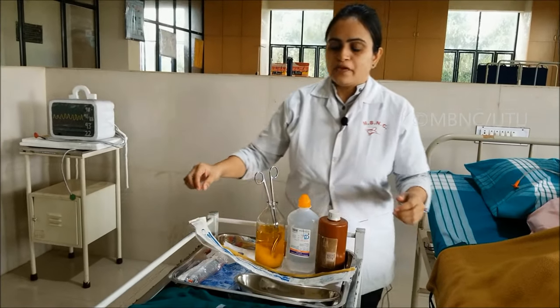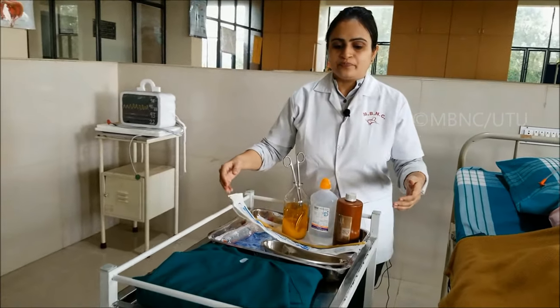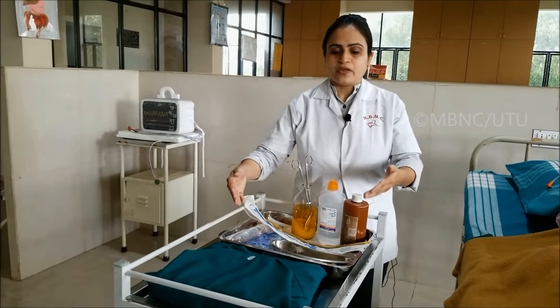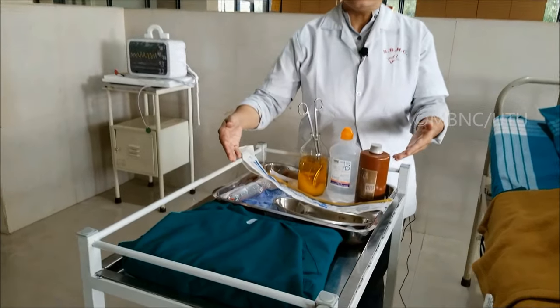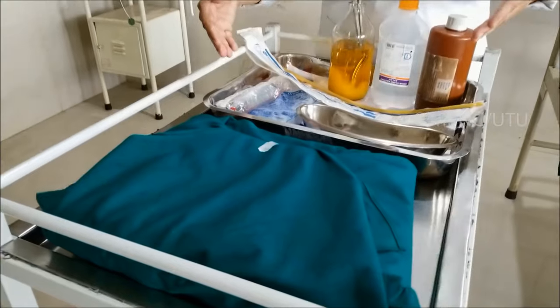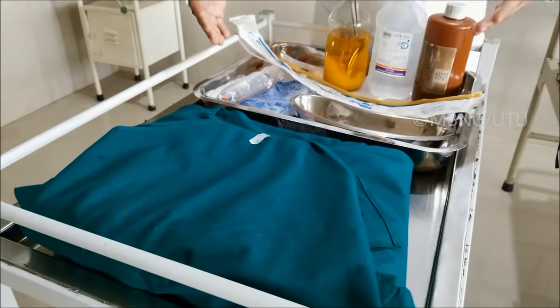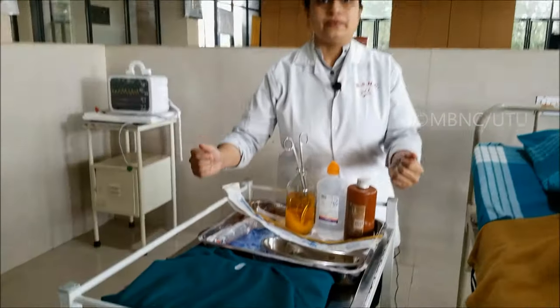The sterile tray contains two bowls, a kidney tray, a fenestrated towel, and sponge holding forceps.